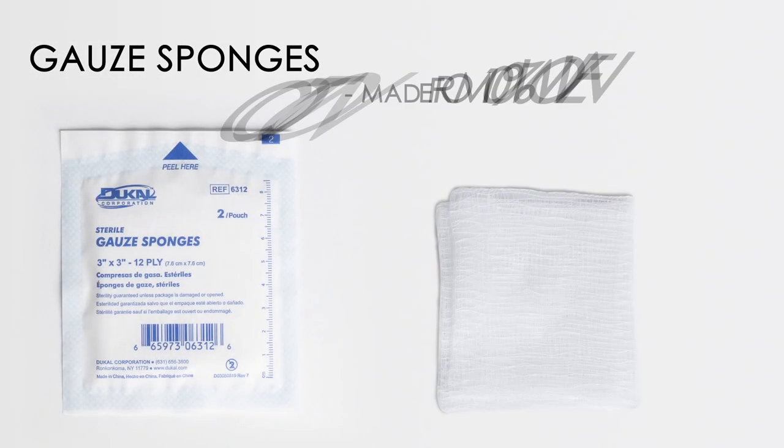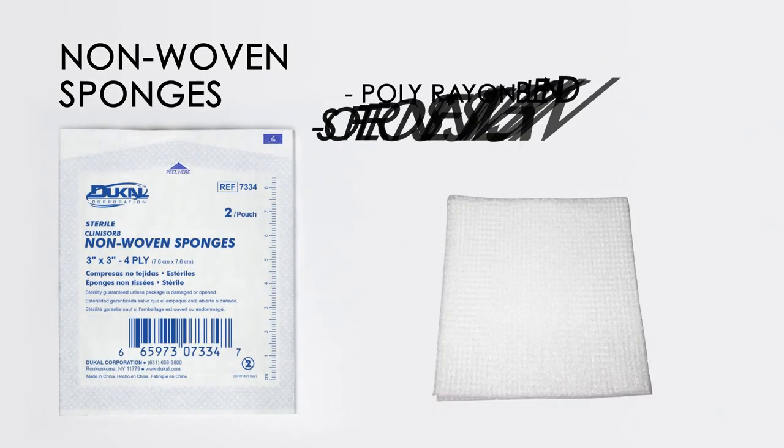Gauze sponges are made from 100% woven cotton. Non-woven sponges are made from a polyrayon blend which makes it softer on sensitive skin.